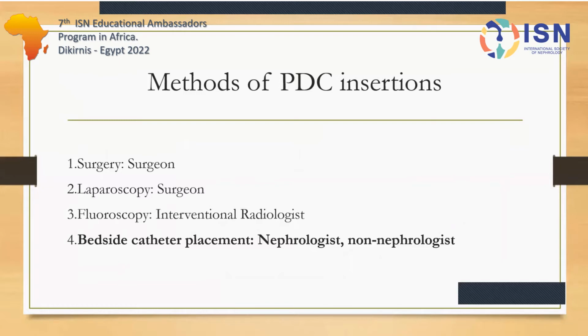Today, our domain, which I highlighted there in black, is bedside catheter placement, which is the primary function of the nephrologist, as well as non-nephrologist colleagues, from medical officers to physicians and even nurses. If they are trained well, they will be able to place the PD catheter at the bedside.